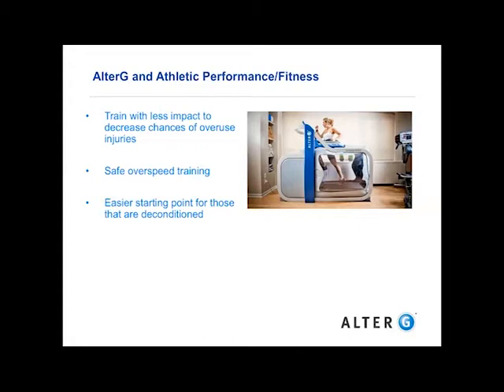You've got to really be working out to get the caloric expenditure that you need. So in the AlterG, you can reduce body weight. You can start again at 80%, 70%, and hopefully whoever is using it can be on for 45 minutes, an hour. So it's another great way for physical therapy clinics to reach out for another cash type of revenue.